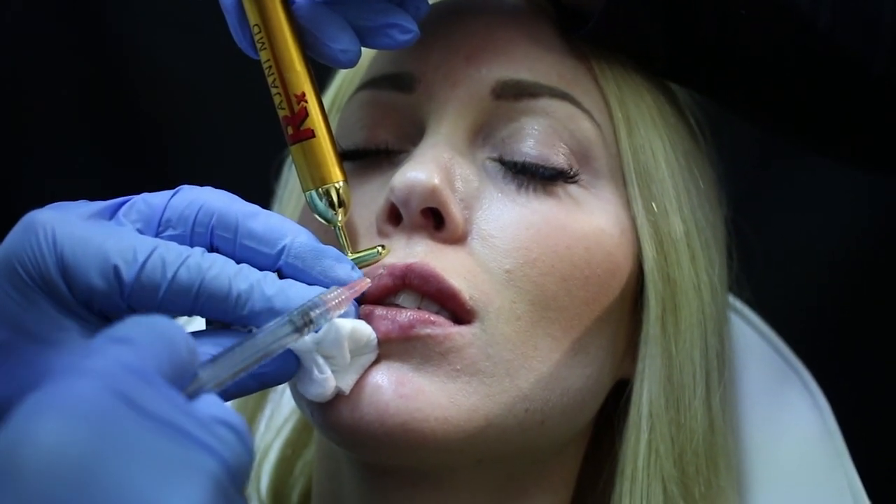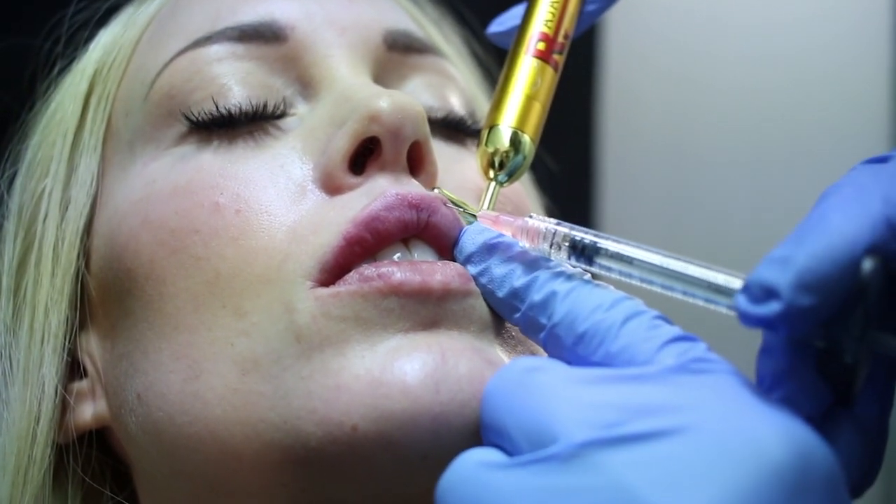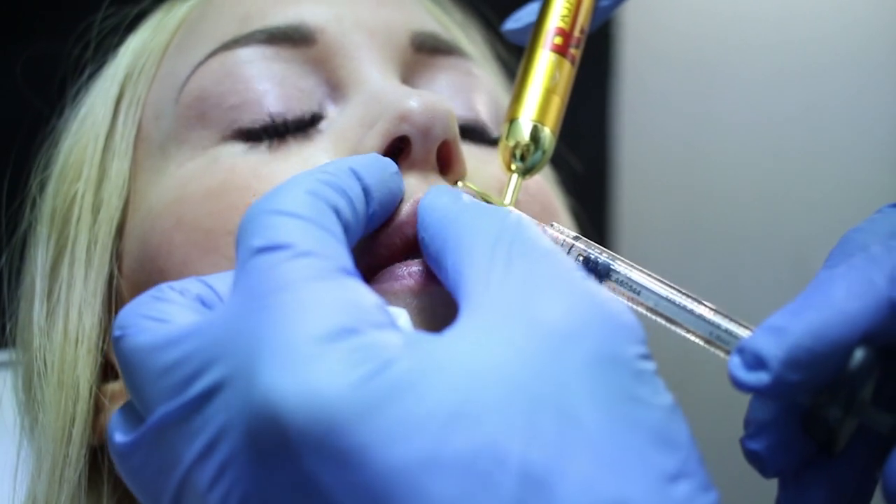We fill the philtrum columns to create an illusion of a shortened distance, and also a very pretty look — especially when we couple it with filling the tubercle, that center part of the lip that people always forget to fill. It's important to ask the patient beforehand if they like it or not. Most patients will say 'I don't know, what do you think?' — so give them your opinion. Your artistic flair and experience in filling this area is key. Use a vibratory anesthetic device, address the central portion, fill the philtrum columns, and reduce the philtrum distance if necessary.